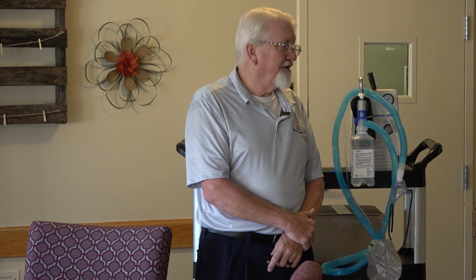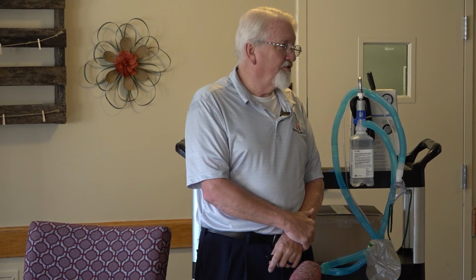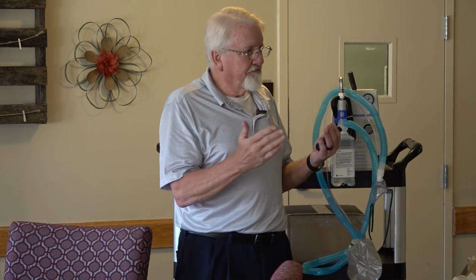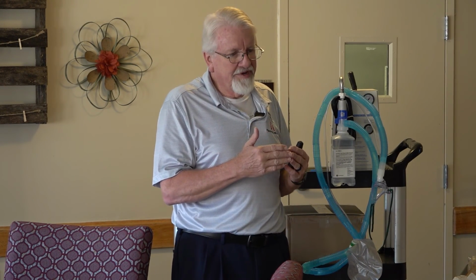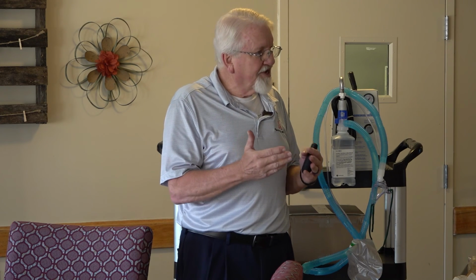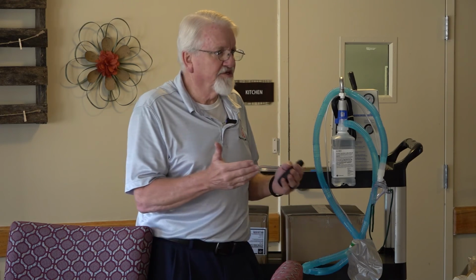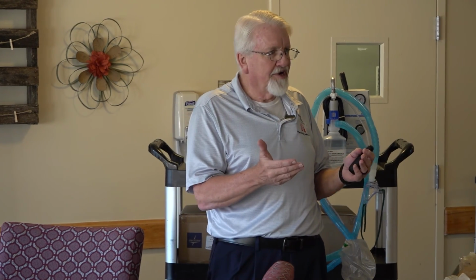Typically what we try to do with trach patients especially, because inevitably their SAT will drop. A lot of patients will, but trach patients for sure, their SAT is going to drop at night.